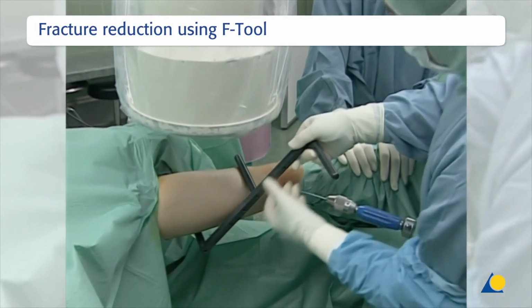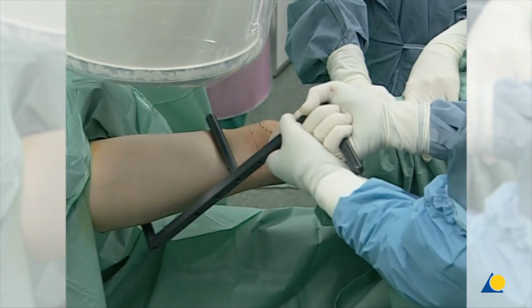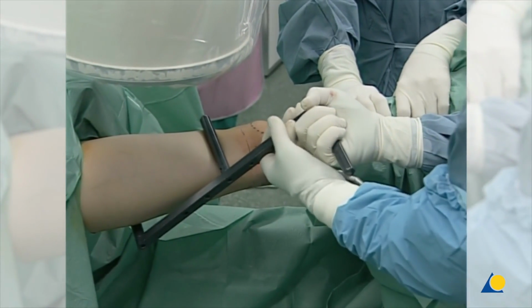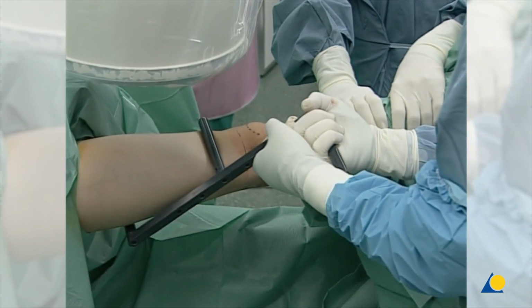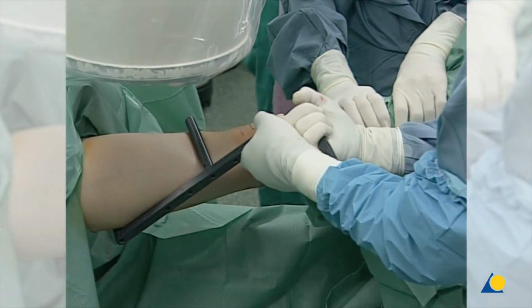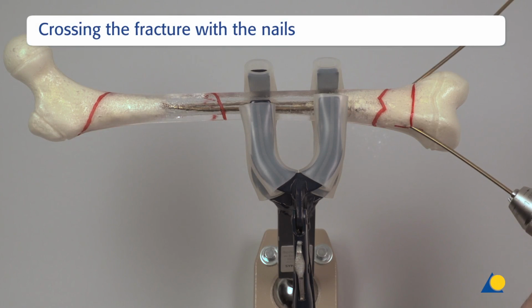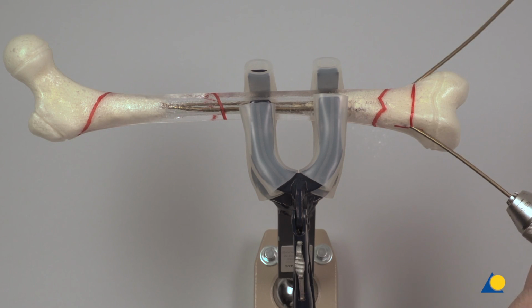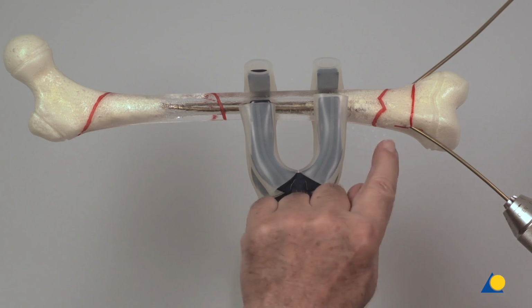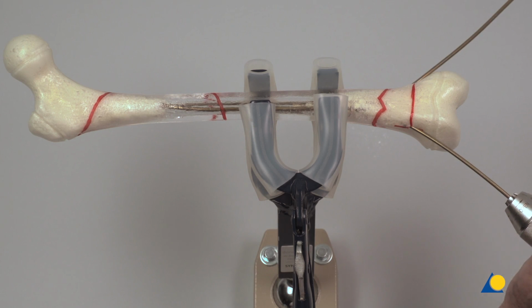The F-tool can be used intraoperatively to perform closed reduction if necessary. The two arms of the F-tool should be positioned as close together as possible. The protruding nail ends can now function as joysticks to manipulate the proximal fragment to achieve precise reduction. Once the cavities are correctly aligned, the nails are advanced alternately with gentle hammer blows or oscillating movements far enough across the fracture zone to ensure that the main fragments are held firmly.